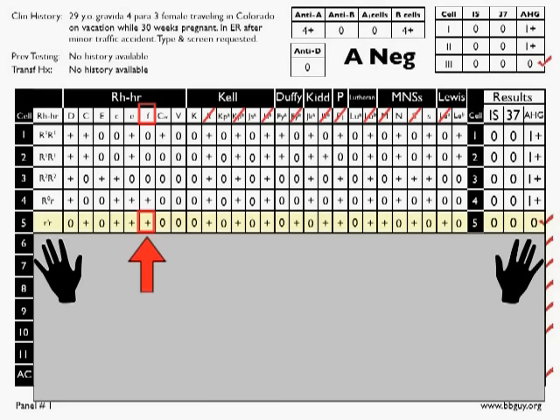Okay, so very commonly, the big E's and little e's and big C's and little c's are separated the way that you see them on this panel right now. So you have to kind of, in your brain or with your pencil, whatever, look at them as pairs. So here we're looking at little e and big E. You see that we have double dose expression of little e. We put a single slash through little e.